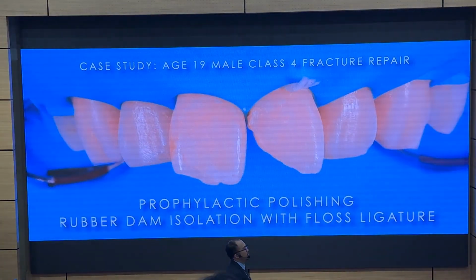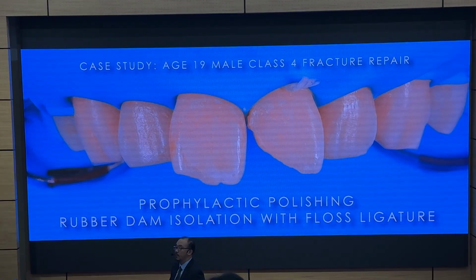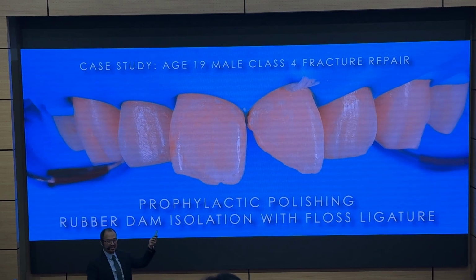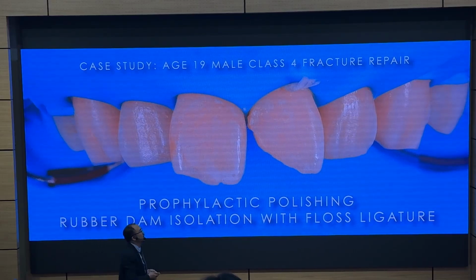Okay? Now, for the patient's mouth, this is what we use. Okay? Rubber dam. A while ago, someone asked me about rubber dam and do I use a floss? I used to use a floss. I don't use a floss anymore. Okay?